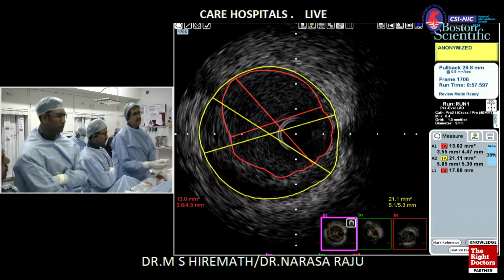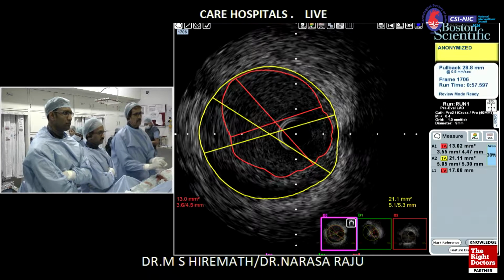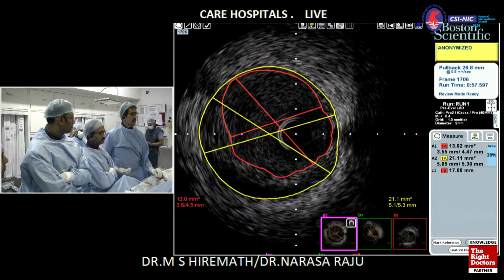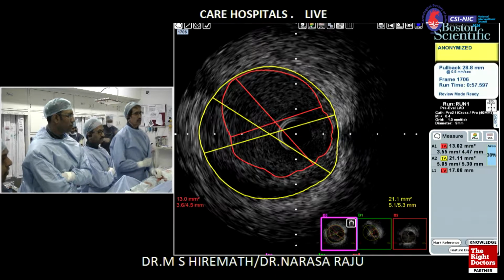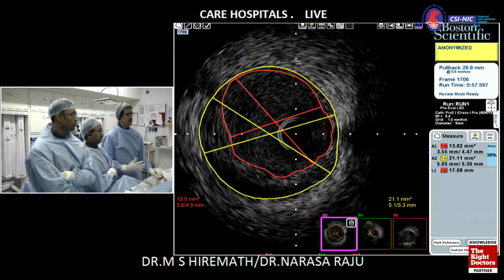No. Here, I think the left main is very long. And I think we have almost half the left main free of disease. So I wouldn't worry to come back to the ostium, especially since the IVUS is showing that from mid-shaft backward to the ostium, the left main has no disease at all. I agree, yeah. So we would be stenting just, show us run number 2 again here. We would be stenting just where the lesion is, say mid-shaft, covering the lesion into the LAD.